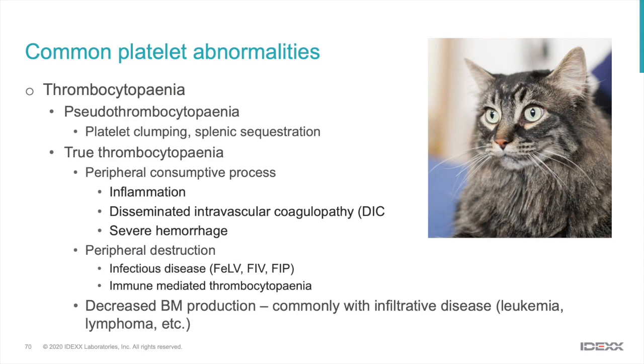Decreased bone marrow production is possible, but remember, this is less likely. And when we do see it, it's most commonly associated with infiltrative bone marrow disease like leukemia and lymphoma.